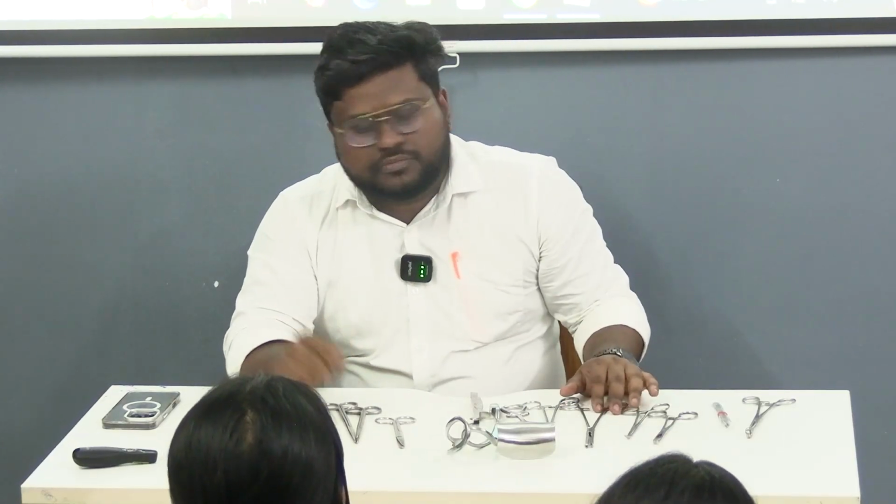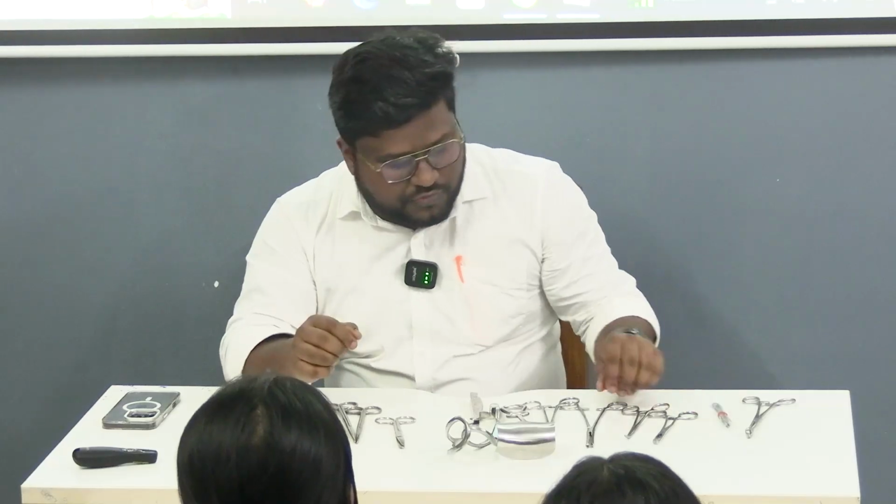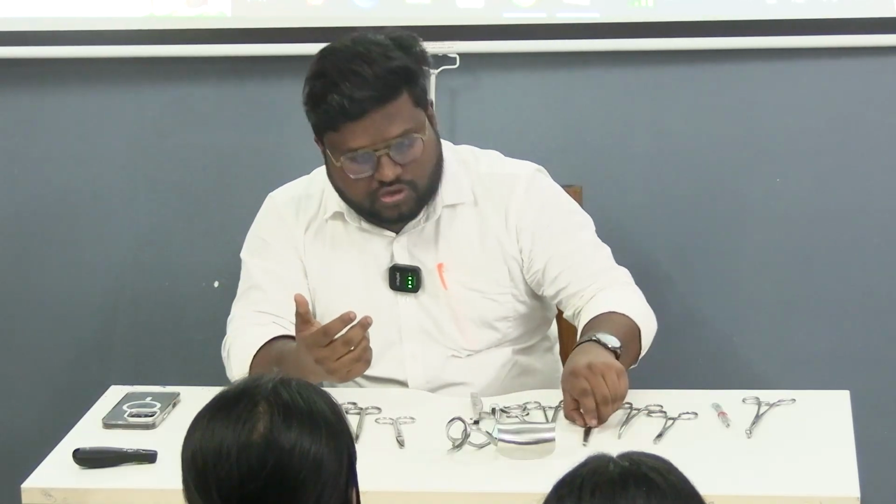Next, আমরা কি করেছিলাম? Incision. Uterus incision দিলাম with this scalpel. We used a blunt instrument like this to make a puncture on the uterus, stretch the uterine wound, লাইকার বেরিয়ে গেল, বেবি আউট করলাম, বেবি আউট করার পরে আমরা বেবিটাকে umbilical cord clamp করলাম with these two.